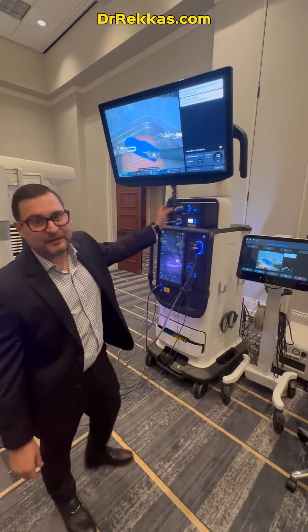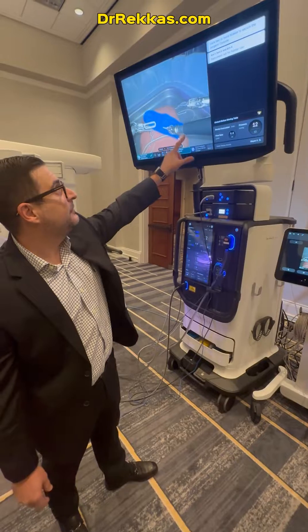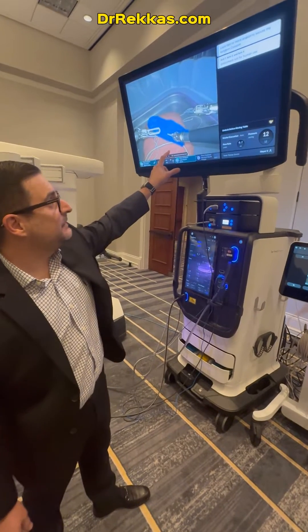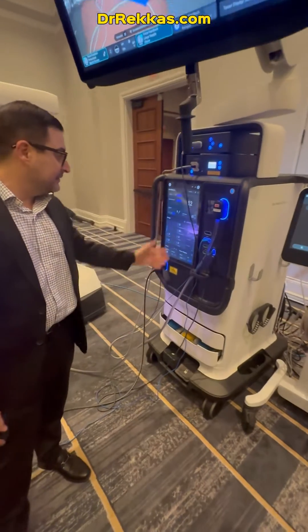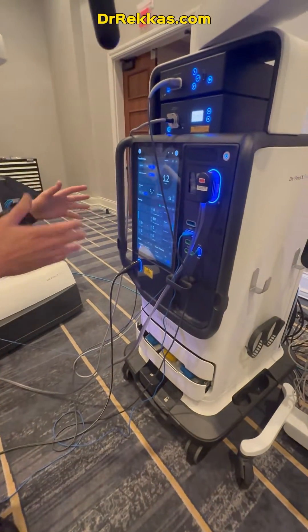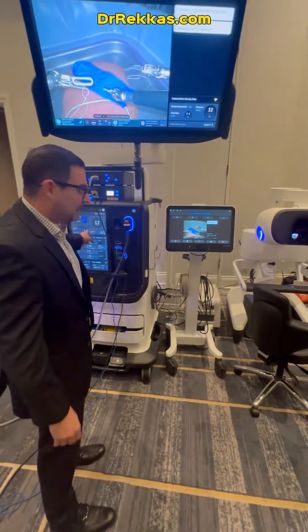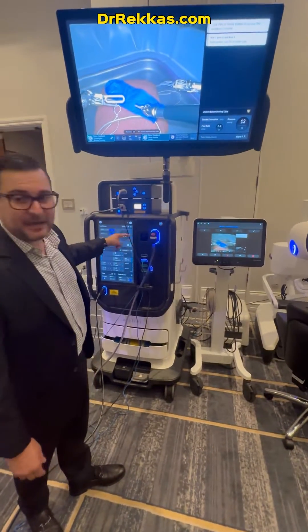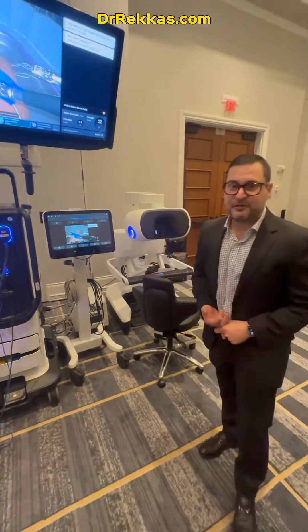We have a whole new advanced visual tower with a bigger monitor and it's all touchscreen. The big surprise here is a whole different tower that has insufflation included, energy included, and basically two camera systems, which is going to save a lot of time and make things much more efficient.